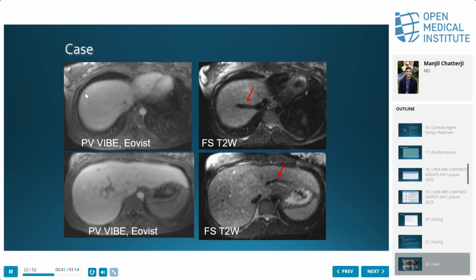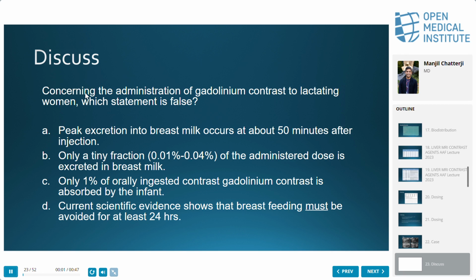So this is the same case that I just showed you, right? The venogram or the arthrogram or the bladder, where the gadolinium is concentrated inside the vein, and that's what's happening here. So even though this is a T2 weighted sequence, after contrast, the T1 and the T2 concentrations at such a high concentration will null the signal. What do we call that? A flow void, but it's not really a flow void, right? Because flow voids are from T2 without contrast. This is actually the darkening effect after contrast. And we do our T2 weighted imaging after injection of Eovist to save time, and I'll show you why.